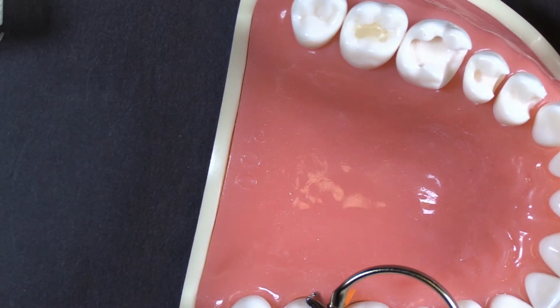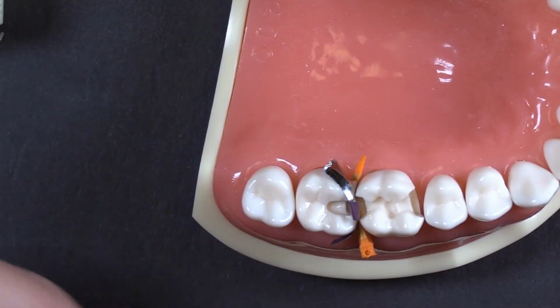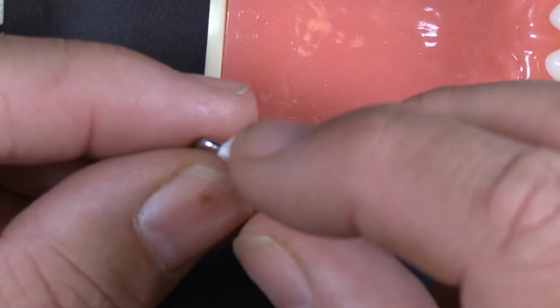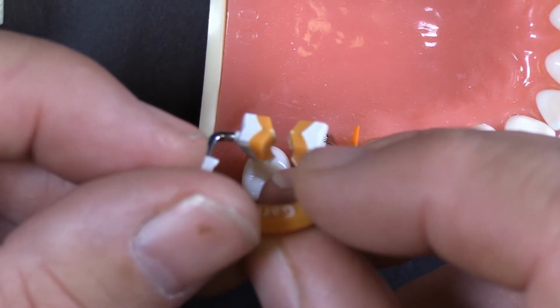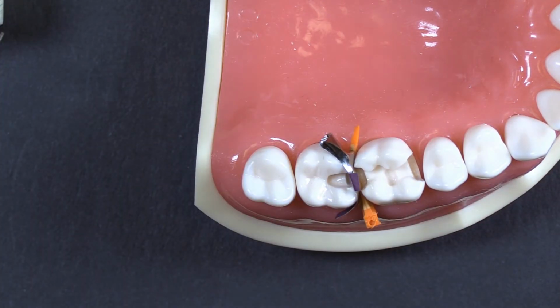The newer rings, it's not quite an issue, but I do see it definitely. Again, the newer rings have a burnish on them. It's a plastic burnish, but it is a burnish, and sometimes that will grab, or the silicone will grab the band and pucker it in. Generally, it's not all the time, but like I said, you can grab that band and tug it back out if you need to. So watch your wedging, that you're not over-wedging, and make sure that you're not over-burnishing as well, or you can end up with some really nasty overhangs.